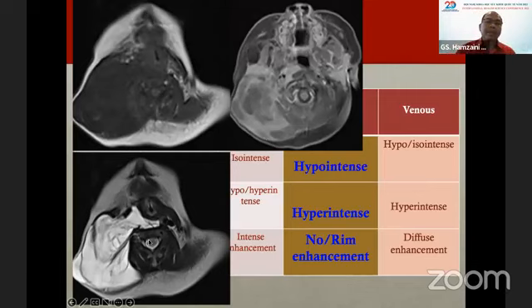What is important in doing cross-sectional imaging, either CT or MRI, is to look at the extension. Like this one, the lymphatic malformation has extended posterior to the airway, posterior to the larynx. So it may cause some airway compromise, especially when you treat the patient, and this lesion will increase in size for one week or 2 weeks. Then we have to prepare the patient's airway properly.